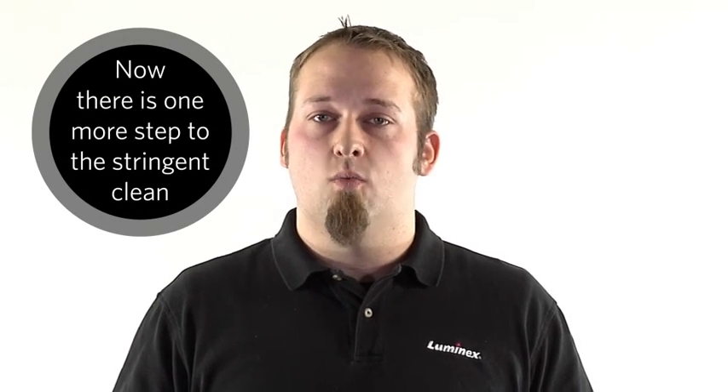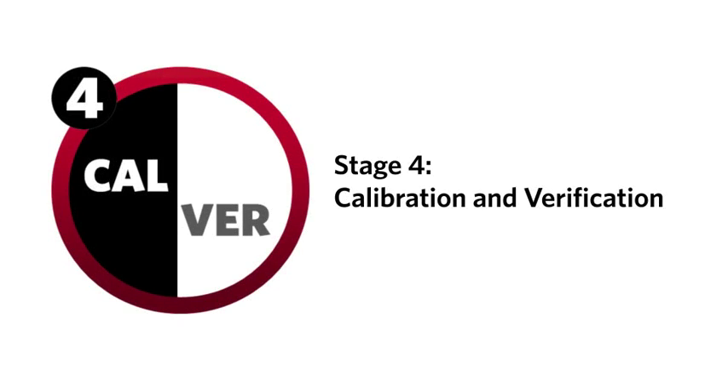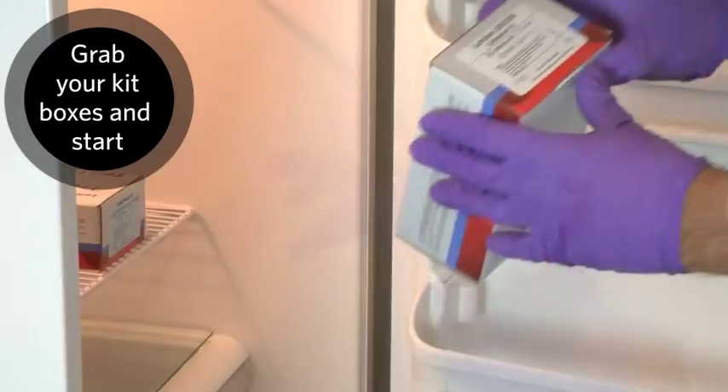With the fluidics lines cleaned, there is one last step to the stringent clean process. Finally, we need to calibrate the system. This will ensure the instrument is classifying and reading results correctly. Grab your Luminex 200 CalVer kit and let's get started.